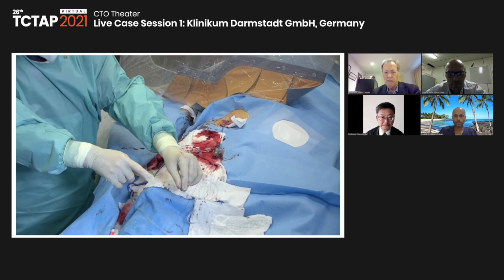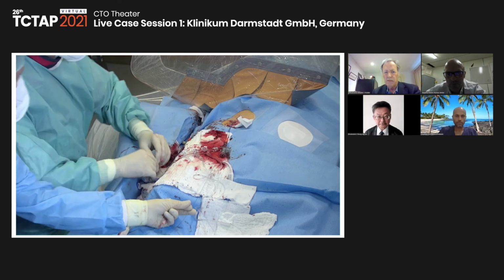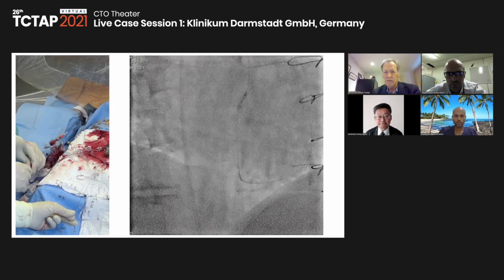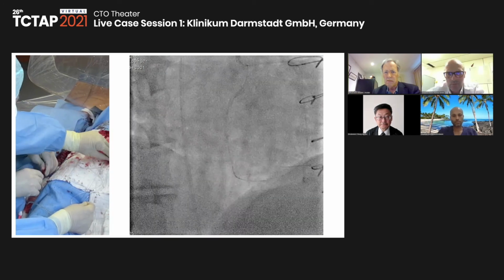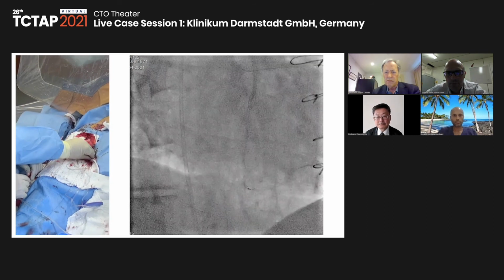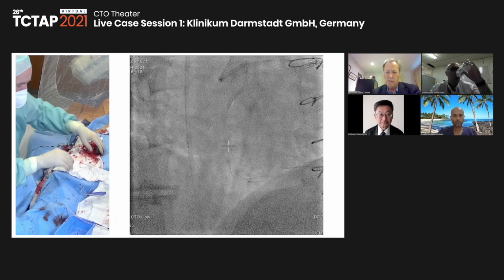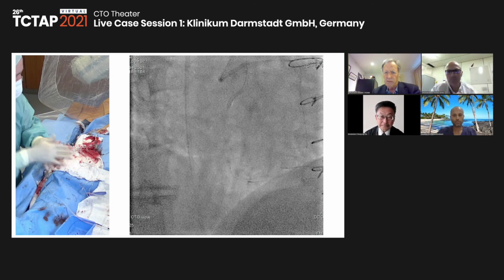So hold this one. This is also an important maneuver. When you remove the Caravelle, again, be careful. It's not a Corsair. Don't twist it. And you saw it's a calcified lesion, but I'm not promoting the Caravelle. If you are happy with a Turnpike LP, if you are happy with a Corsair XS, use it. I just show you that it's a very safe instrument if you are careful. I broke only one tip of Caravelle among the probably 600-700 I used.